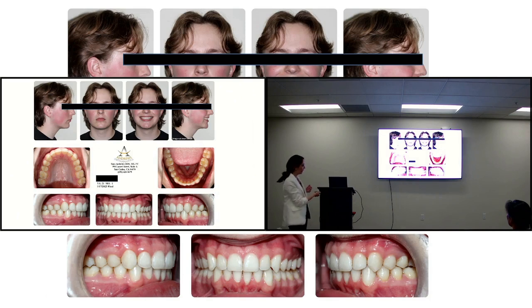It's not perfect. And he did tooth whitening. I mean, he's super happy. He's finished pretty nice. But even when I see him for retainer check, I'm like, I did that. I caused that, right? But it got a lot better. And to answer your question, I see that happen all the time. You recover. You regenerate tissue. I have seen that happen too in a couple of lower tiers. So now, based on how their teeth are and the gums are, yeah.